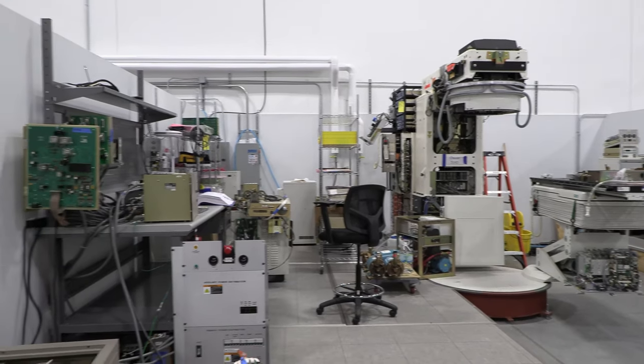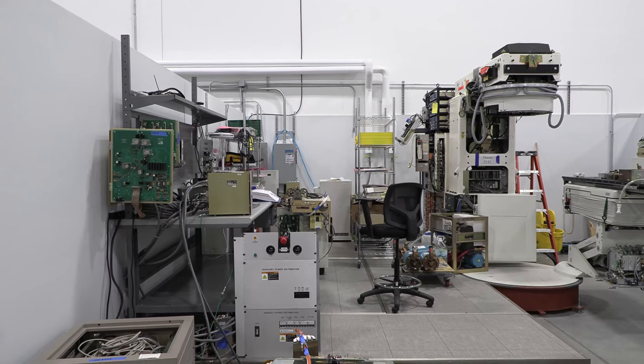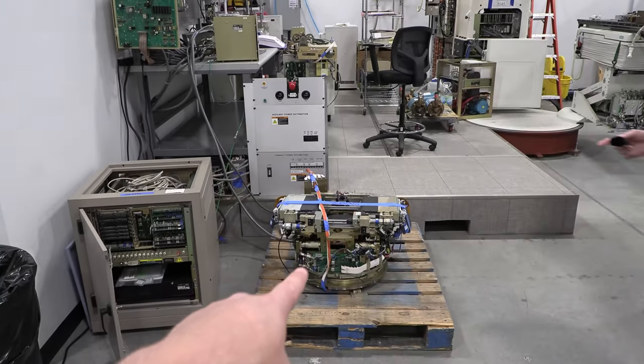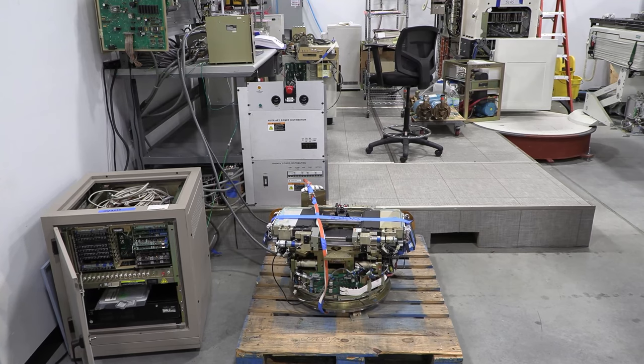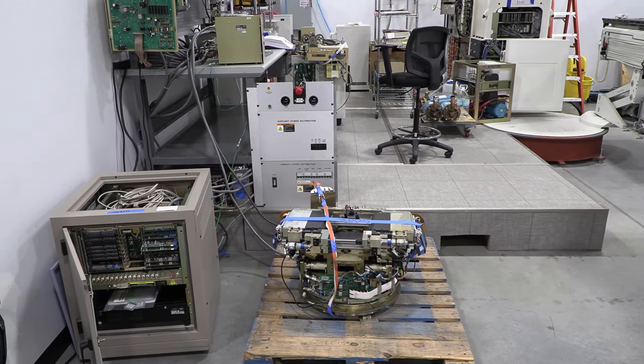And I do a little bit of testing on the Siemens, but 90% of our parts that go out are Varian parts. Is that down there, is that the collimator? This is the MLC. That's the part of the head that collimates, so I can show you. Hopefully we have the MLC running over there. That looks very heavy. Yeah, each bank.